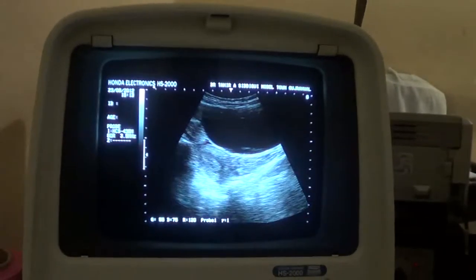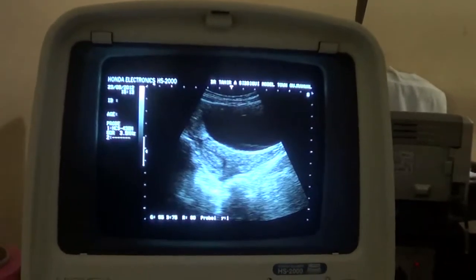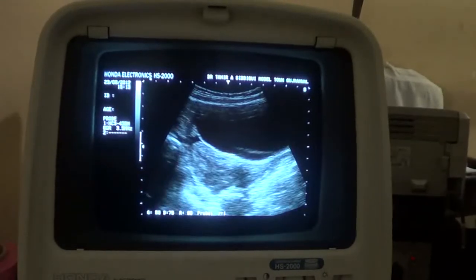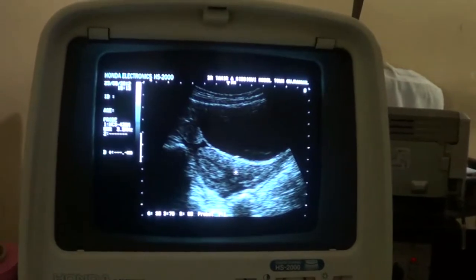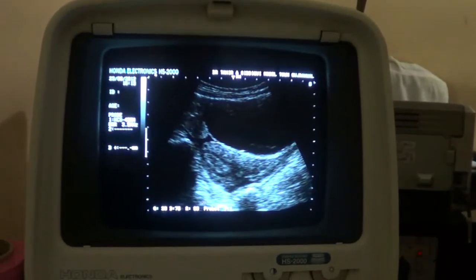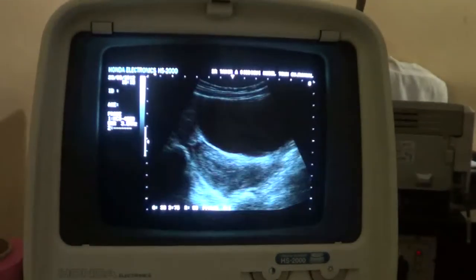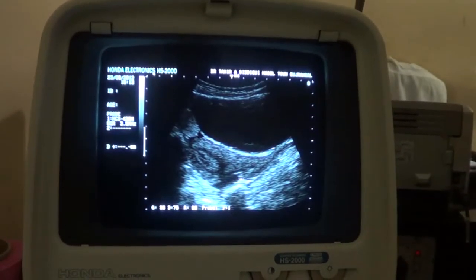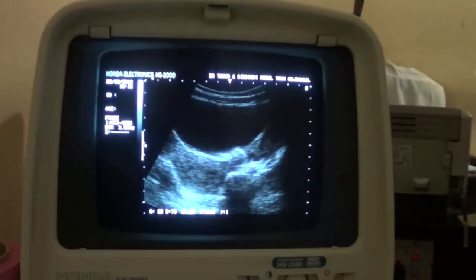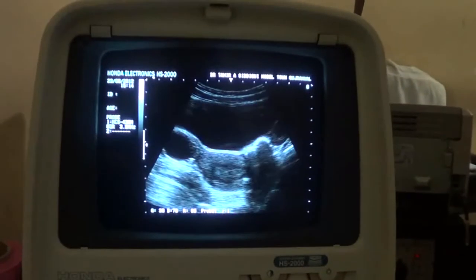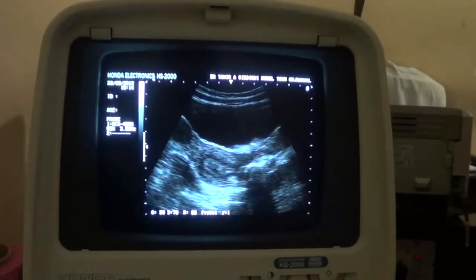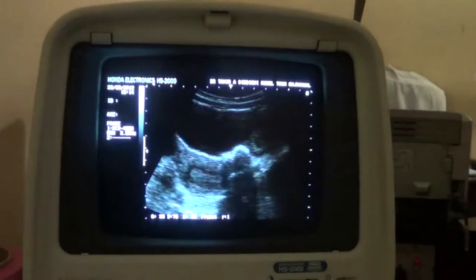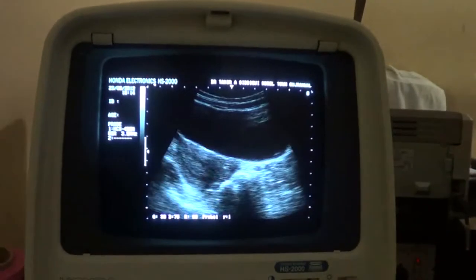We do see fluid in the cul-de-sac. This black area is the fluid — this is the fluid line. This is more clear here: this is fluid in the cul-de-sac. And when I go transversely, I see fluid again in the cul-de-sac — that curvy cavity.